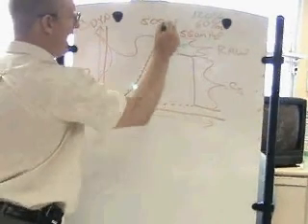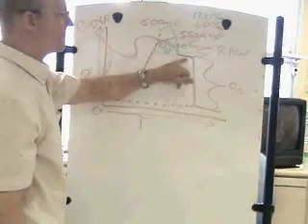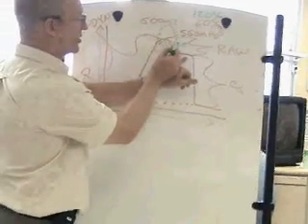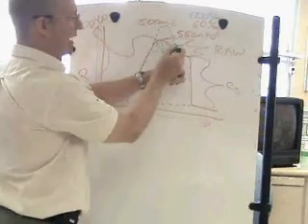You will now have a higher peak inspiratory pressure, but look what happens to the plateau pressure. It stays the same. Well, why would that be? Well, changing the size of the endotracheal tube or changing the flow rate didn't change your static compliance. It had to do with how much airway resistance was going on.